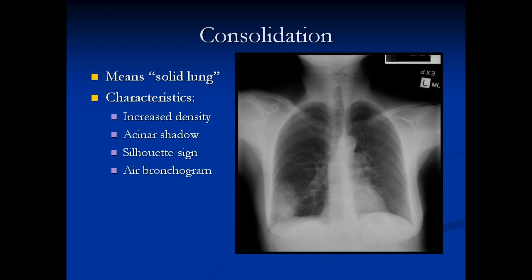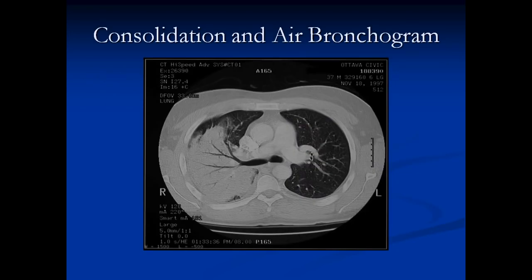Thirdly, you'll see that the diaphragm immediately adjacent to the area of consolidation is completely gone — we can't see it. We can see the diaphragm central to the consolidation and into the costophrenic angle beyond, but right where the solid lung is, we cannot see the diaphragm. This is called the silhouette sign. One of the other changes we look for in consolidation with airspace disease is an air bronchogram. Here I've shown a lobar pneumonia — you can see the bronchus branching out into the pneumonia. Those black branching lines are called an air bronchogram, and that is another characteristic of airspace consolidation.